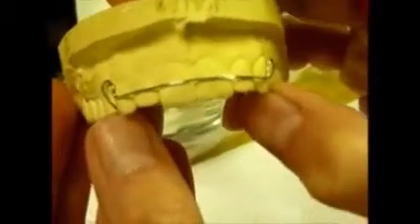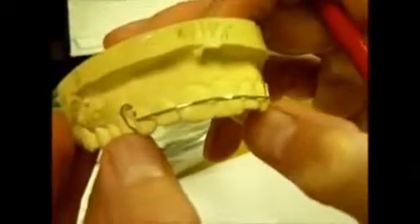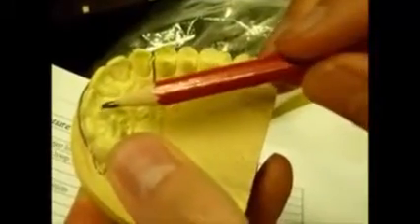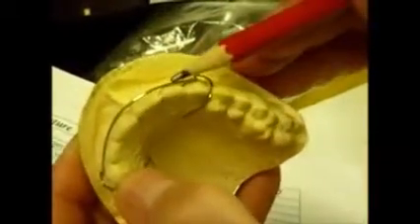So we look at loop height, we look at the bow being level, because it just needs to look nice, and I'm sure it's not very important actually, as long as it holds the teeth. I would say that it needs to go about halfway up the teeth is the most important bit, because you've got acrylic on this side, and you're trying to sandwich the teeth between the acrylic and the bow. So if the bow's very low on the teeth, then you get torque. So then you might get tip. Yeah, you might be able to rotate the roots of the teeth if you activated the bow. So you want to have it, what they usually say, in the middle of the teeth.